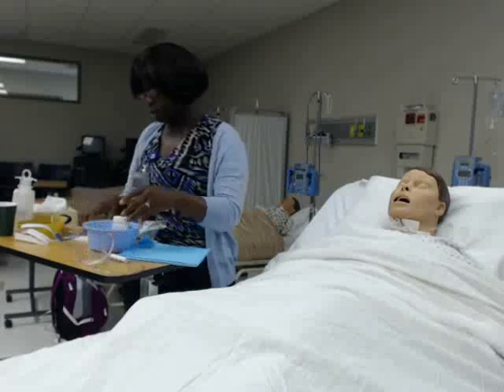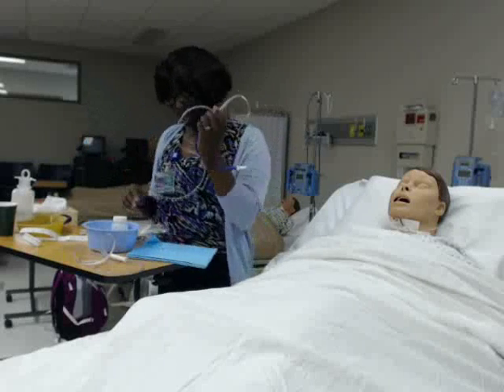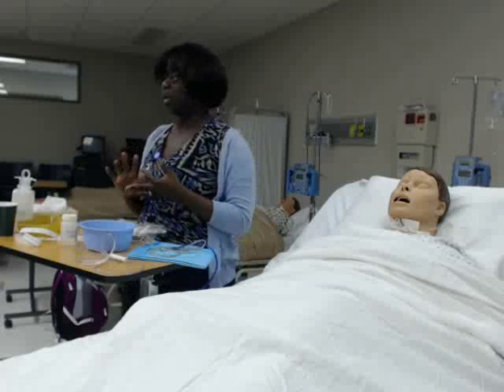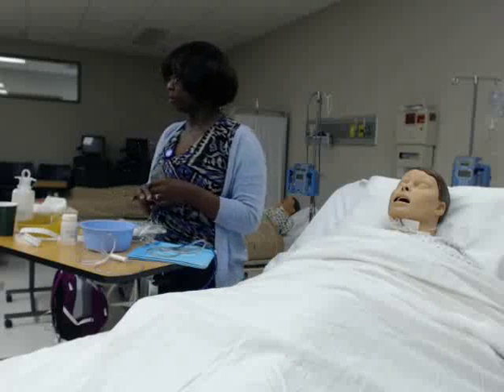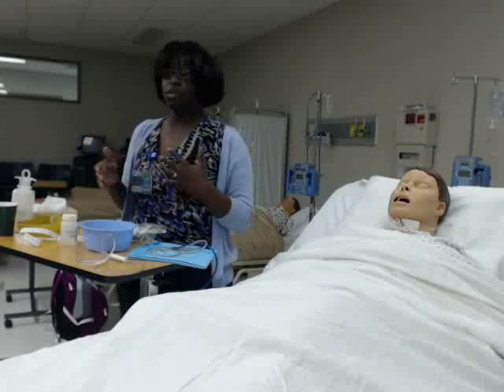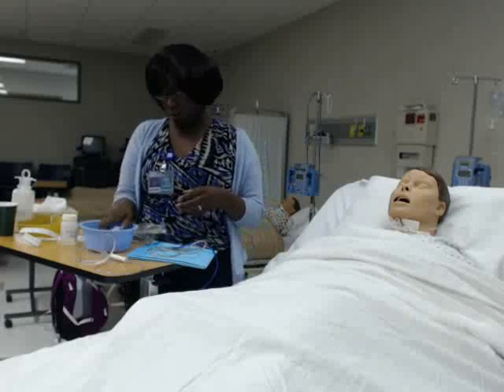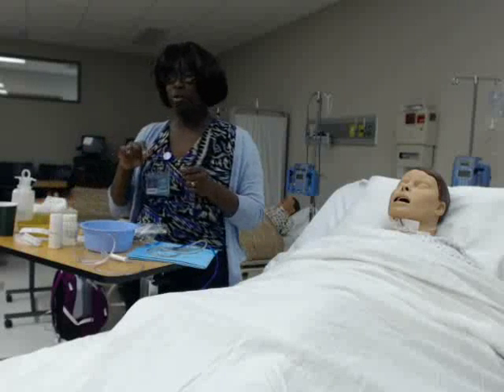We're going to insert the Salem sump today. You want to make sure you have all your supplies: a blue chuck pad, your tubing, some normal saline, and some water-soluble lubricant. We use water-soluble lubricant because it matches what's in our systems — using a different kind could increase the chances of the patient getting aspiration pneumonia. For lab purposes I have to use a spray lubricant, but in the real world you'll have a little packet of lubricant.